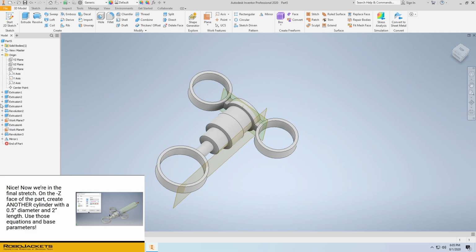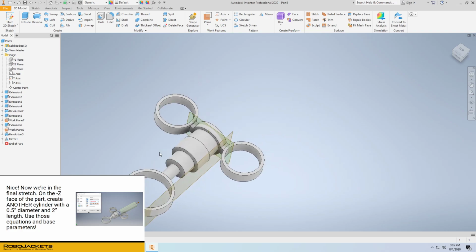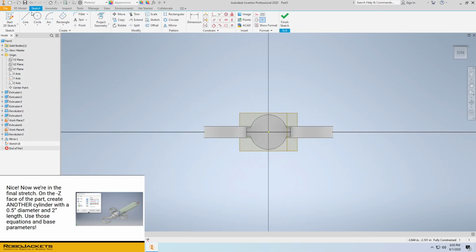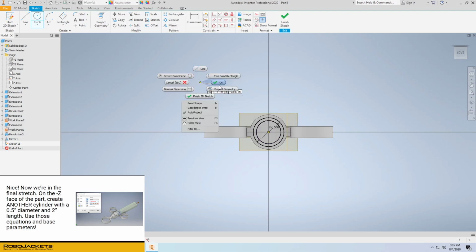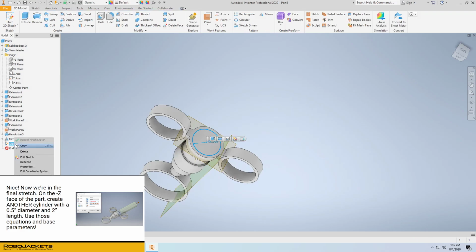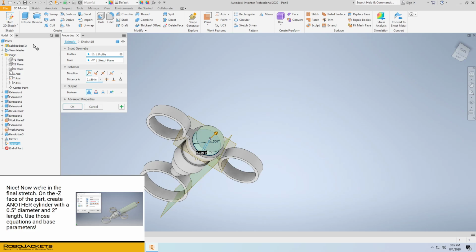Now we're going to create a longer cylinder, once again based off of parameters. So we'll head back over here. We'll create a new sketch. Diameter of the circle should be 0.5, and that was our original main diameter. So we'll just name it main dia. There we go. That's a projected geometry. Go ahead and extrude our sketch.